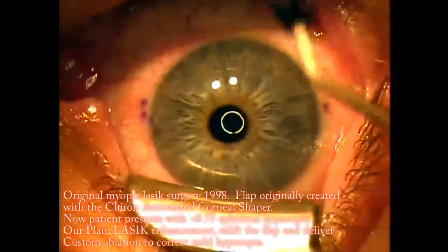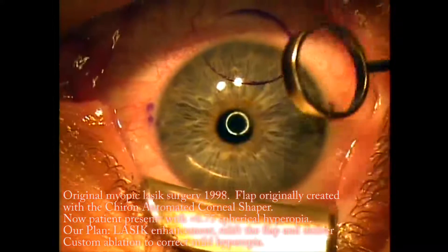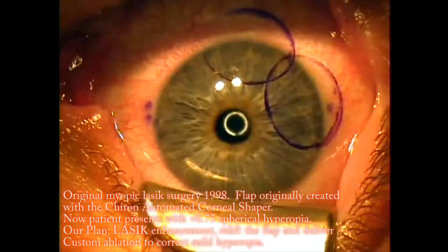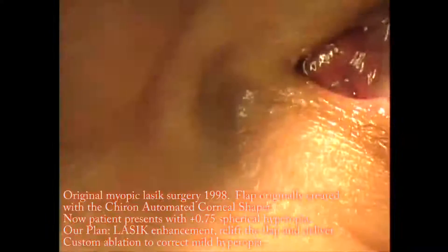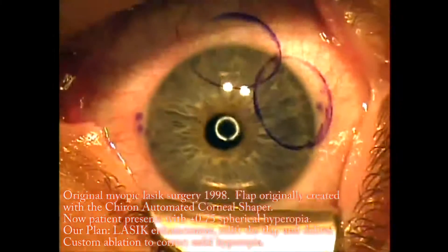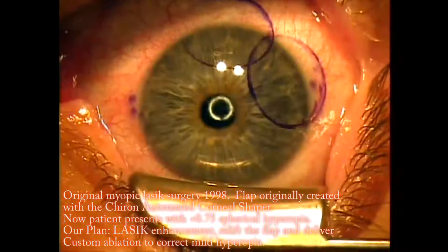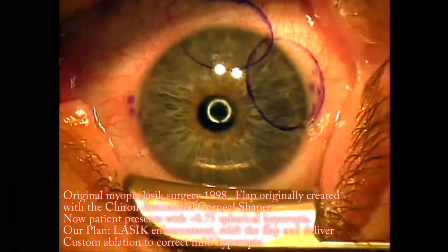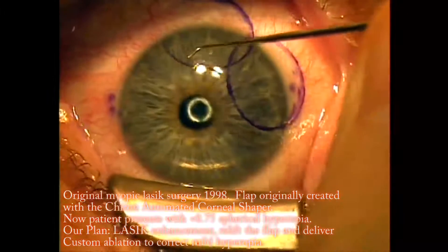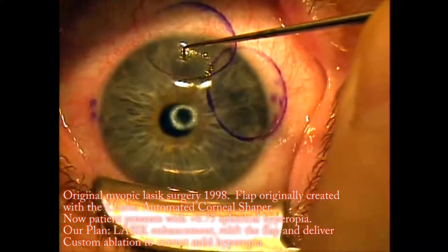This is Dr. Shannon Wong. I'm going to demonstrate in this 14-minute video three key concepts: the first being how we lift a flap for a LASIK enhancement, the second being how epithelial cells can grow underneath a re-lifted flap, and the third being how we manage removal of epithelial cells that have grown underneath the flap. This patient had myopic LASIK in 1998. His flap was created with the Chiron automated corneal shaper with a nasal hinge. He's now slightly hyperopic, so we're going to re-lift the flap and deliver a custom ablation to correct his +0.75 diopters of spherical hyperopia. The patient is numb with topical drops.